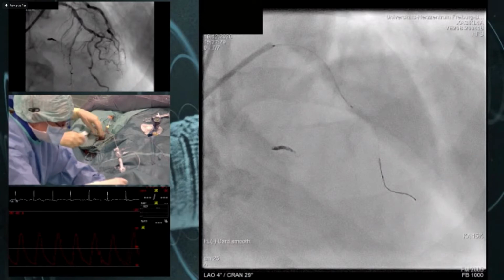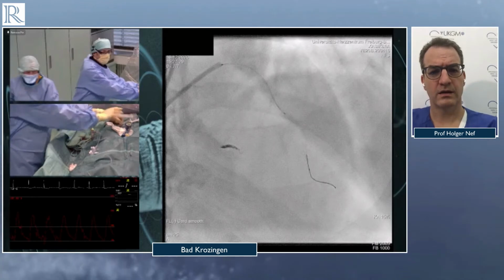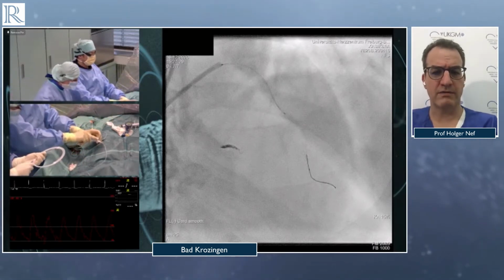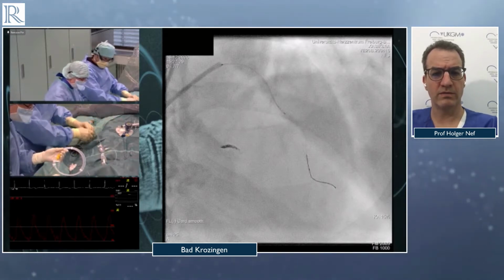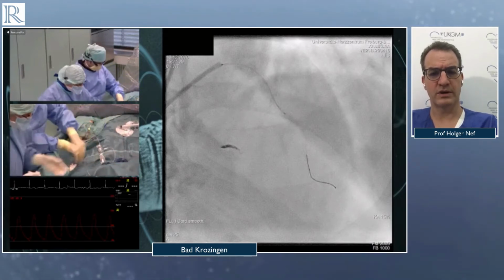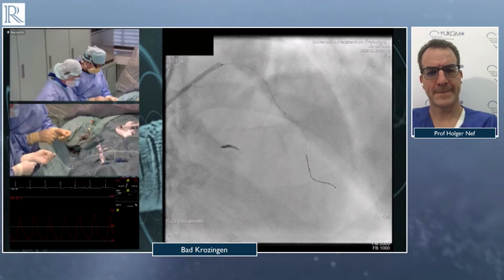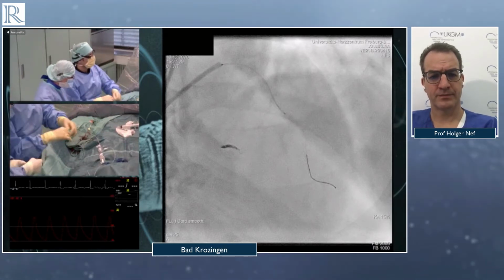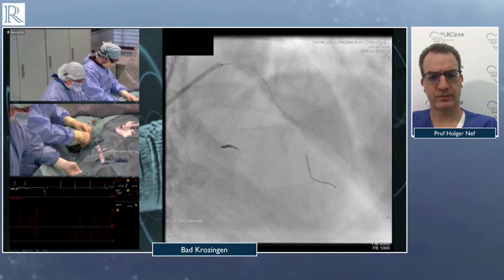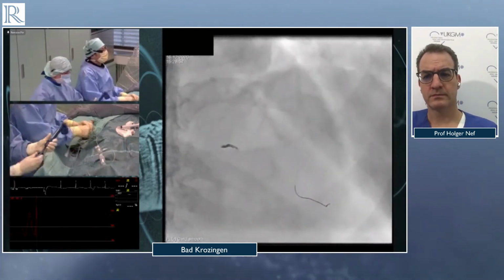So this is another question I have. Kind of lesion. After IVL or post-IVL, do you always use a post-dilatation, and which size would you go for? For post-dilatation, right? So I recommend you to do this, even if I rotablate with a 2.0 burr. I always use a non-compliant balloon to see how it looks.